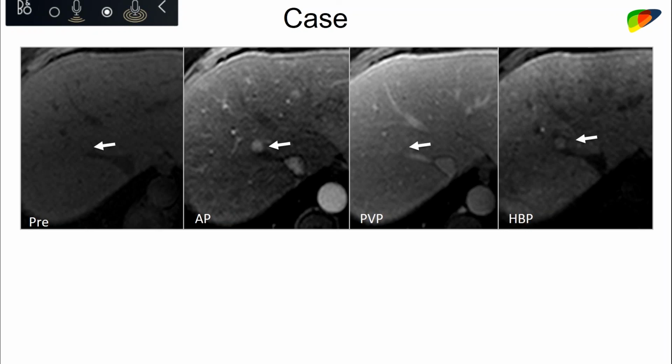The third thing I'd say, and this is not in LI-RADS, and this is speculation on my part, is that those two lesions look different. Both have hyperintense arterial phase, but one is taking up the gadoxetate and the other one is not. One of them clearly does not have washout, the one with the arrow on it. The other one may have some washout, and may have a little bit of a corona in the portal venous phase. So I don't think these two lesions are genetically the same.